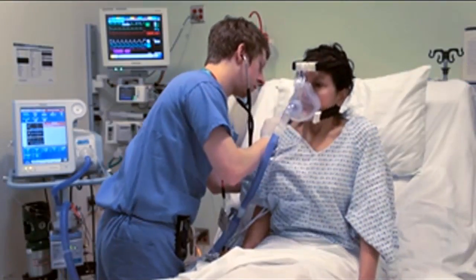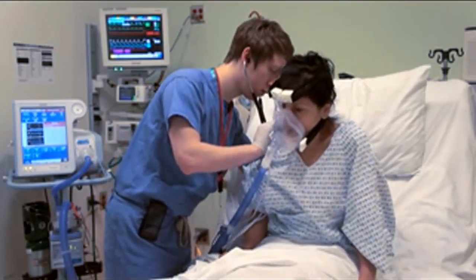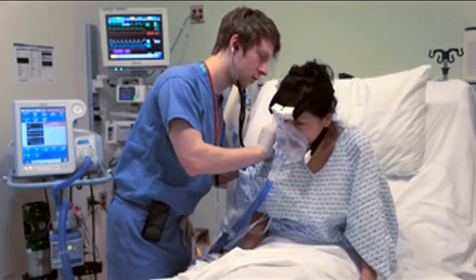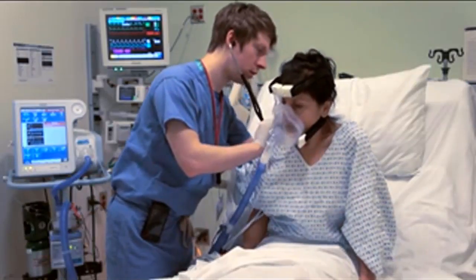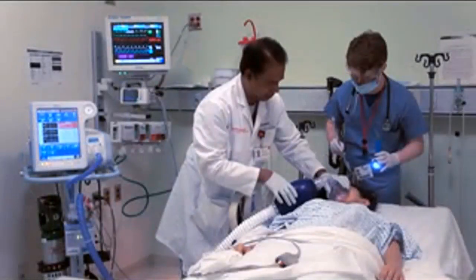If the patient has persistent respiratory distress despite adjustments to the ventilator or mask, or if a contraindication to BPAP develops, such as vomiting, perform endotracheal intubation immediately.